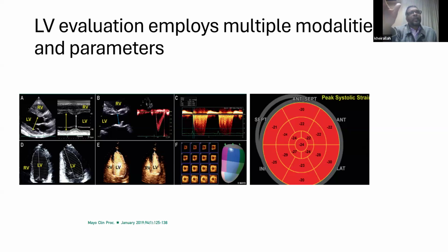Usually, almost always, we reach a precise diagnosis as to LV function in echo, and we don't need to go any further. In a few circumstances, we might go for cardiac CMR as the supreme court to judge ambiguous cases or to have additional information that is going to be helpful in decision making. But usually echo settles almost all the details we need for decision making.